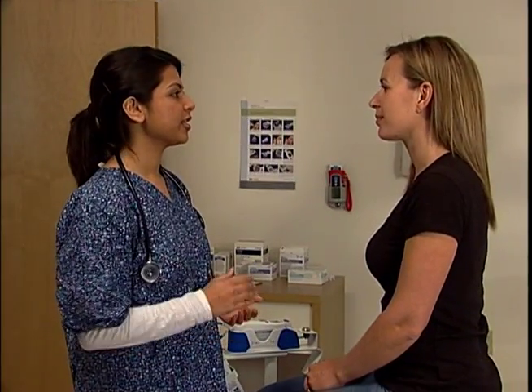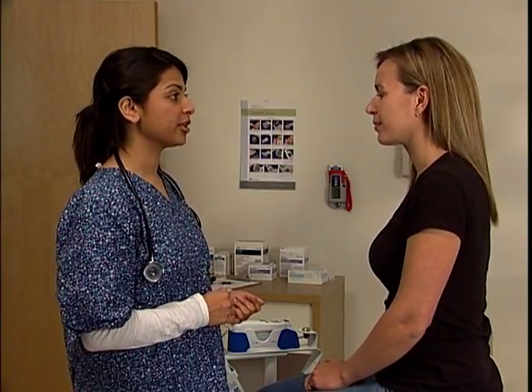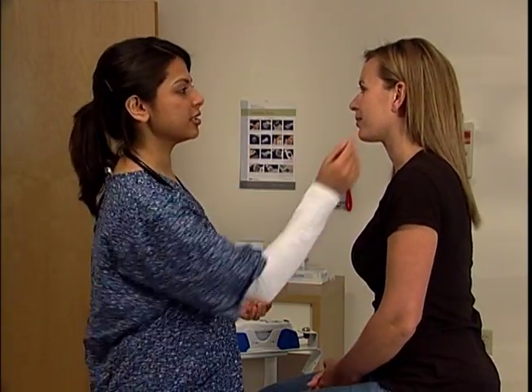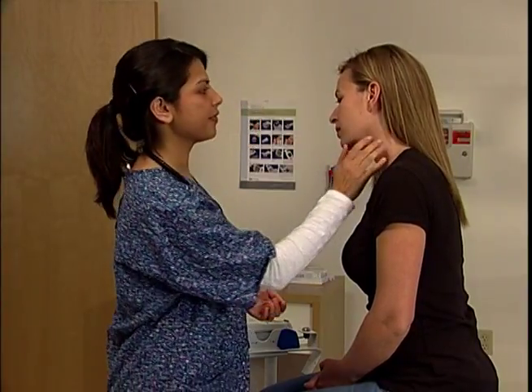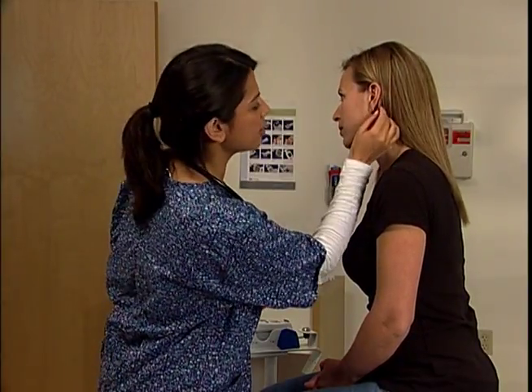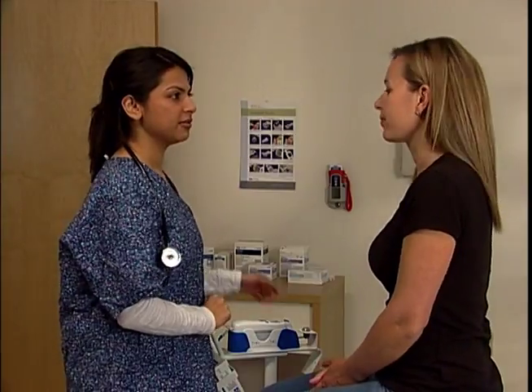To perform a reading, first inspect the patient's ear anatomy for proper placement of the probe tip. Make sure the patient's ear is free of blood or any other fluid. The ear should have no obstruction and should be free of impacted earwax.